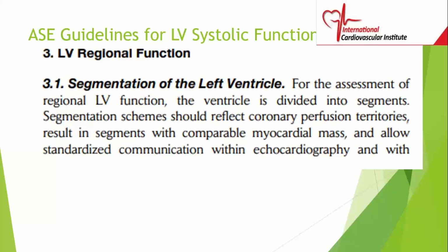Now, most of you know the concept of segmentation of the left ventricle, and we divide the left ventricle into segments, and you have to know the segments. Okay. We have a 16 segment model, we have a 17 segment model, and we even have an 18 segment model. Most literature will talk about the 17 segment model.